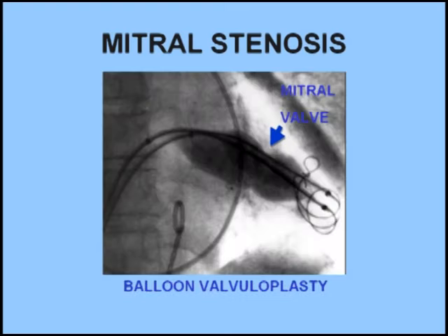In patients with appropriate anatomy, mitral stenosis can be treated by a balloon valvuloplasty procedure as shown here.